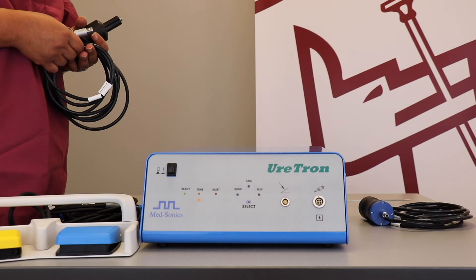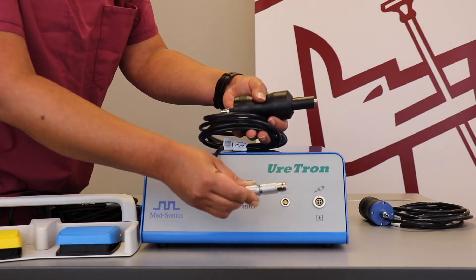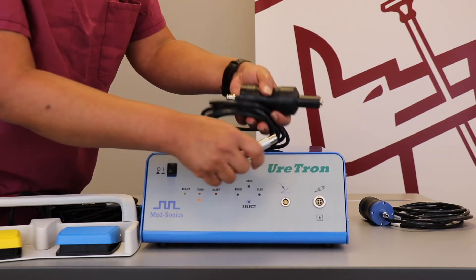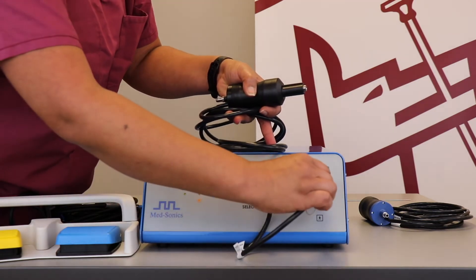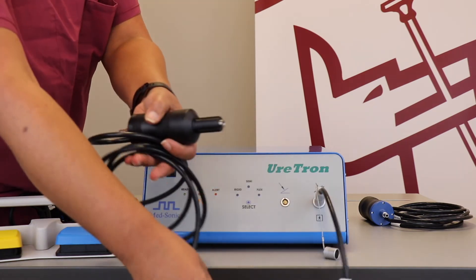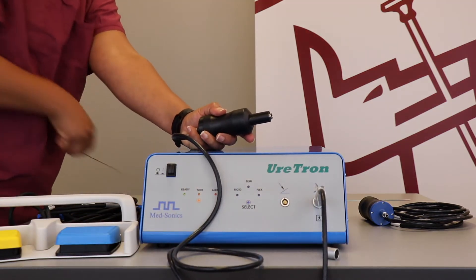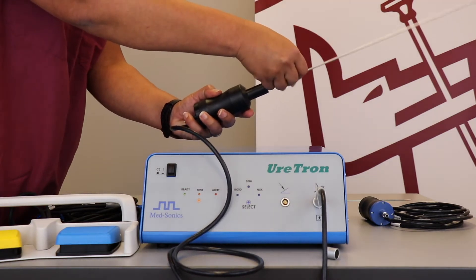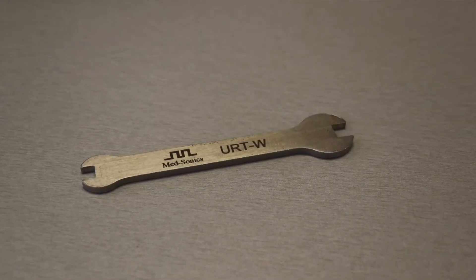First we will connect the all-black rigid handpiece. As you can see there is a picture on the unit that shows the transducer, and the way to connect it is by lining up the red dot to the red dot. Once that is securely plugged in, you will select your probe and securely hand tighten it. Once it is securely hand tightened, you use the wrench which comes with the system to securely fasten it.